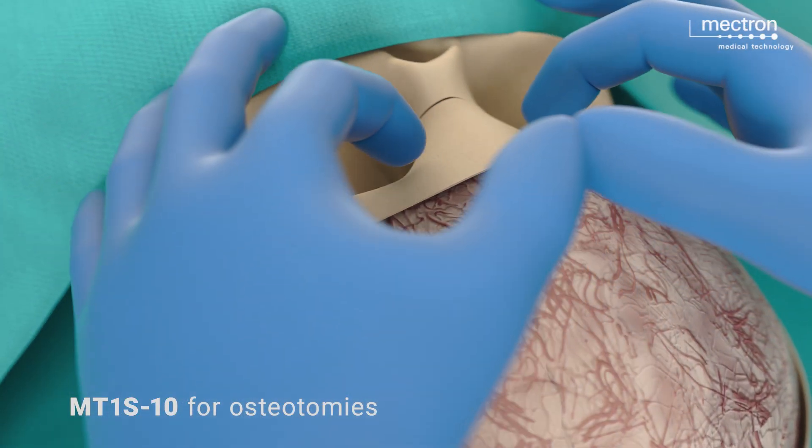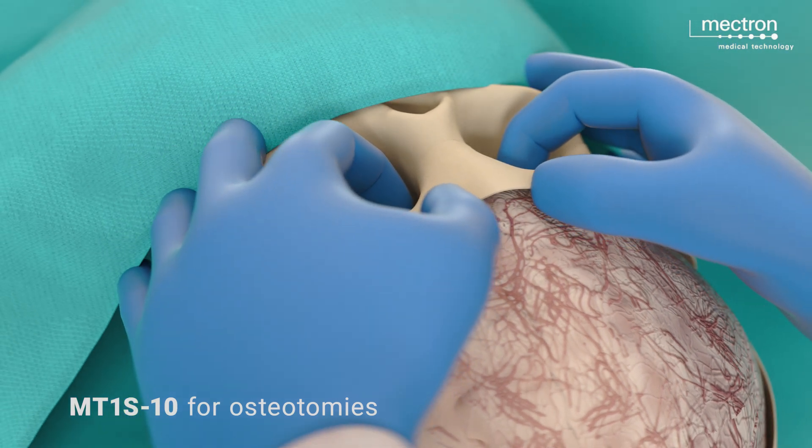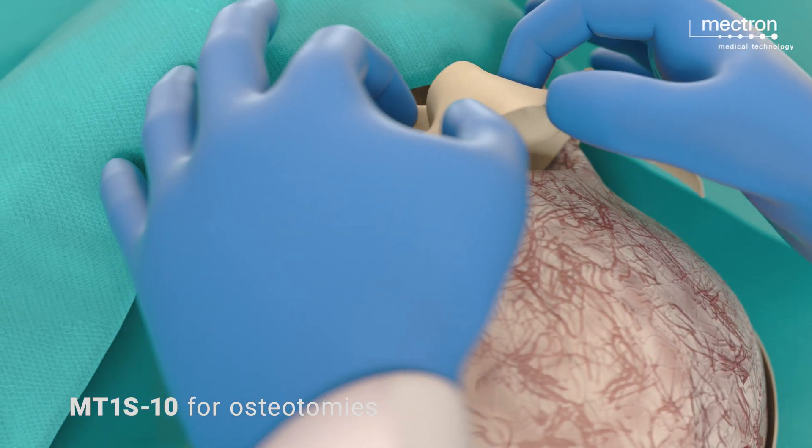After completing the osteotomies, the orbital bandeau is mobilized from the two orbital capsules through blunt dissection.